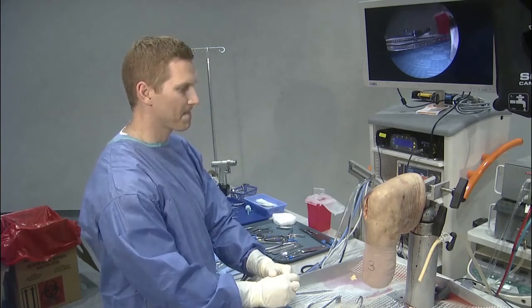Do you feel like, before we get to your implant, any of your indications have changed using MACI compared to ACI?